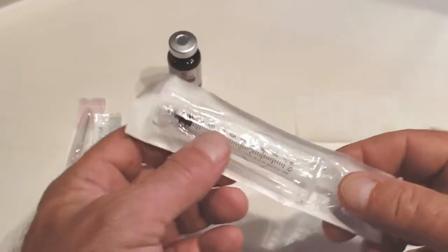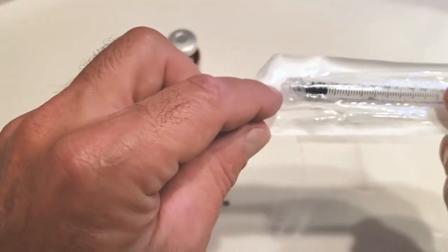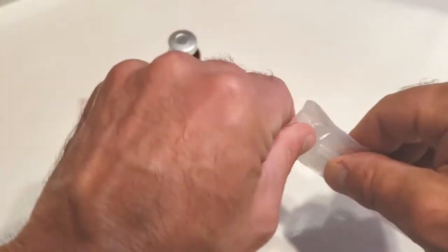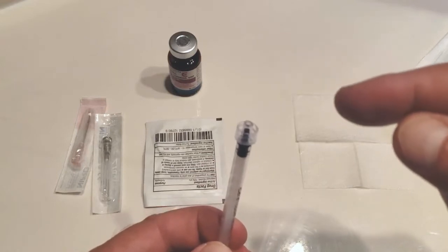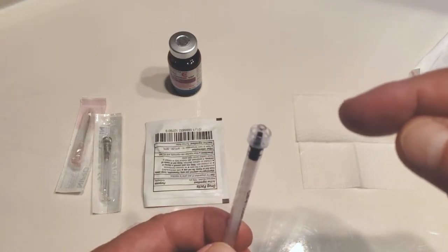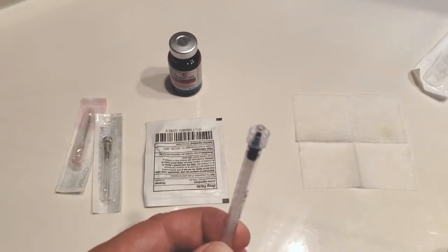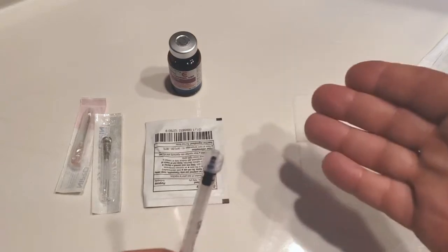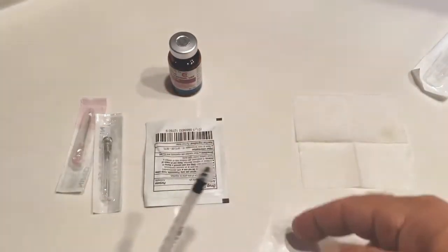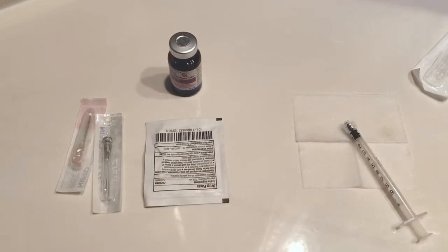Here we have a 1ml luer lock syringe. This is the sterile end right here, so I'm going to open it from the non-sterile end. This sterile luer lock has no bacteria inside anywhere I can touch, so you have to never touch it to something that has bacteria on it, like the outside of these packages or the tabletop. I can set that down on my sterile pad.